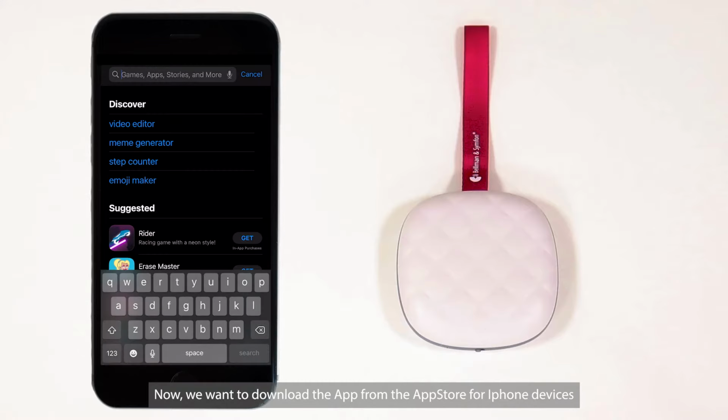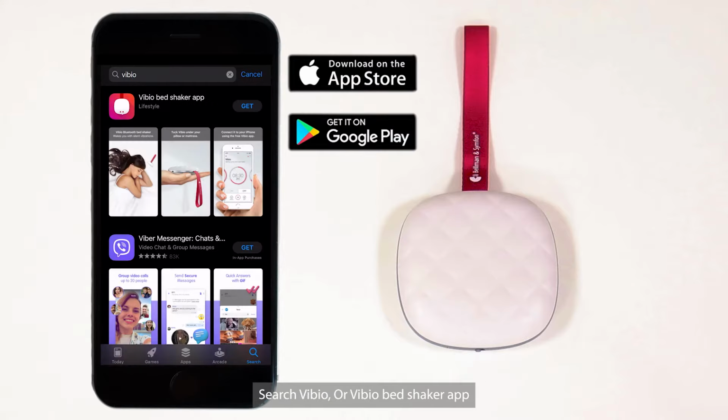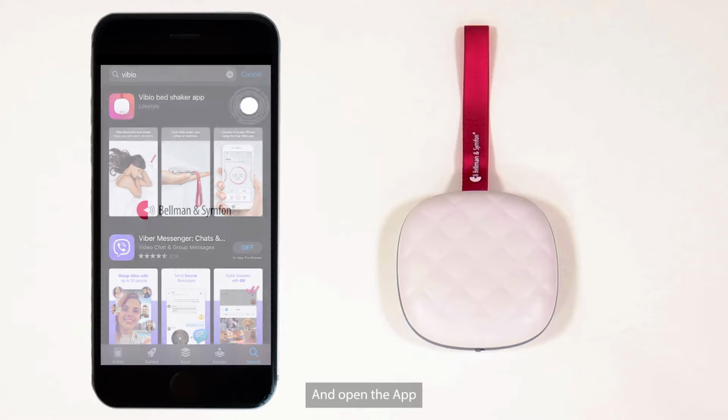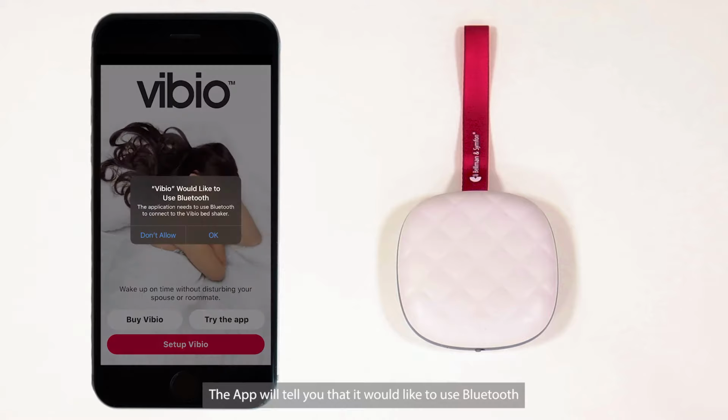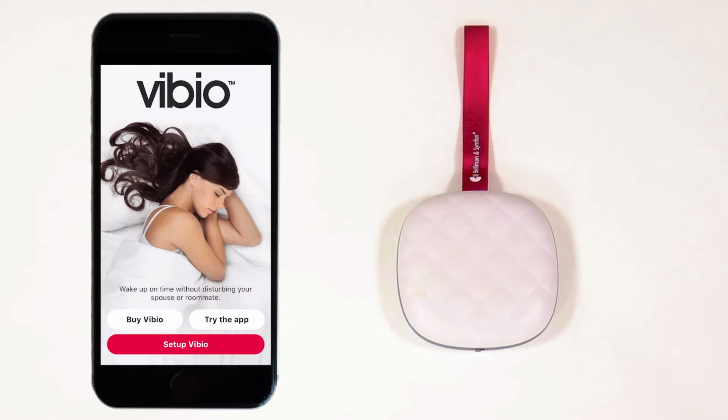Now, we want to download the app from the App Store for iPhone devices or Google Play Store for Android devices. Search Vibio or Vibio Bed Shaker app. It should look like this. Download it and open the app. The app will tell you that it would like to use Bluetooth. You must allow to pair your phone. Press OK. Then press Setup Vibio.